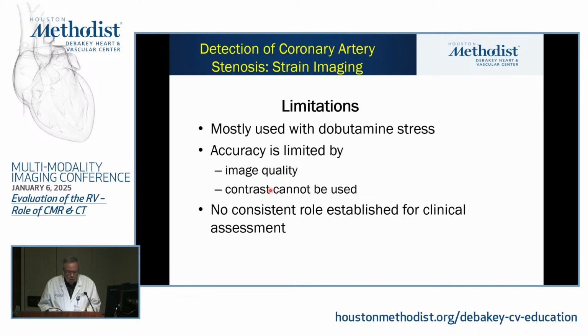And you cannot use contrast. Right now, except for one company that allows some strain to be done with contrast in the cavity, pretty much all the machines that we have, and all the ones that most people generally have, cannot manage contrast and strain together. So for those reasons, there is really not a lot of use of strain today in stress testing.